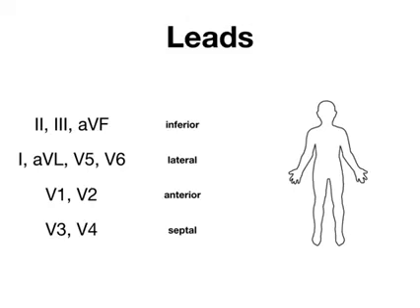When I was a medical student, it didn't really make a lot of sense to me that where the leads were in space corresponded to different parts of the heart. Now, if you're going to be a cardiologist, maybe you understand that geographic orientation, but I didn't go into cardiology. So I needed a different way to memorize this. So how I did this was with a few mnemonics.